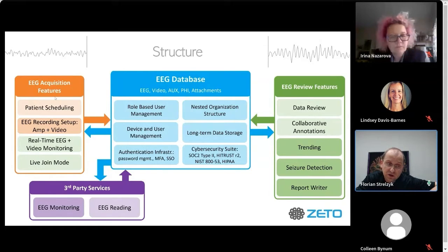Now, that is an optional feature. That is something that accrues additional costs. But for some facilities, that's really the only way they can offer the full end-to-end EEG diagnostics, because locally it's just really hard to find the right personnel.